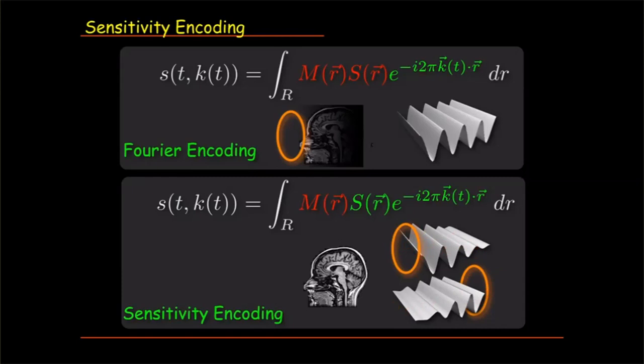And effectively, when I define it this way, here I get one encoding function, one inner product at a time. Here I get two at a time. And this is where maybe I can use that in order to speed up the acquisition.